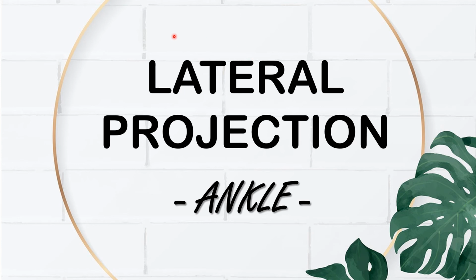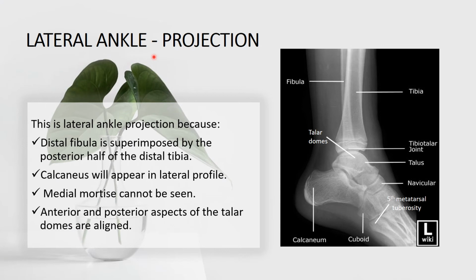Okay, we continue with the lateral projection of the ankle. Okay, this is the projection of the lateral ankle. As you can see here, this is the radiograph of the lateral ankle projection.